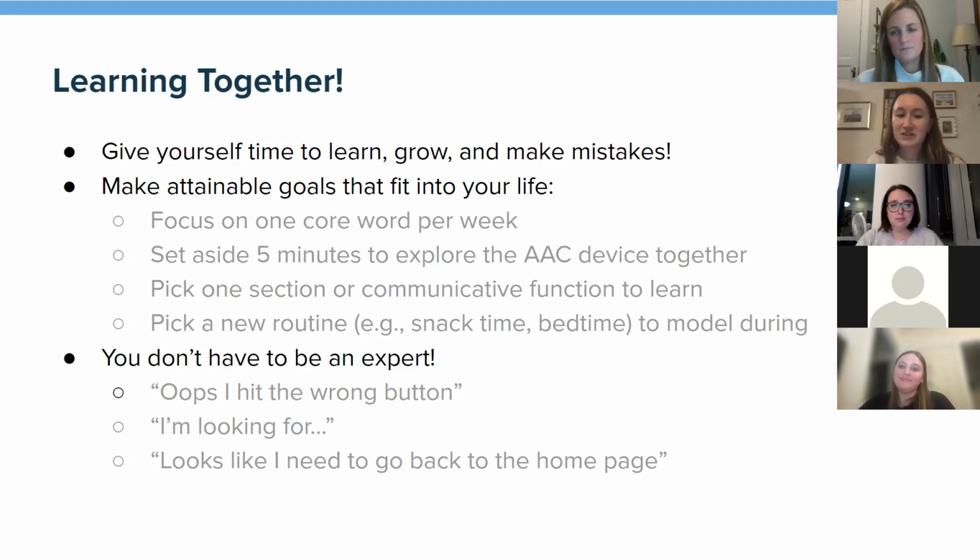Even us SLPs, you'll hear us saying these phrases all the time of, oops, I hit the wrong button, or I'm looking for XYZ word, or I have to go back to the home page and try again. All of those things are okay. Like I said, us SLPs do it. It lets your learner know that you're learning with them, you're trying and navigating that device together.